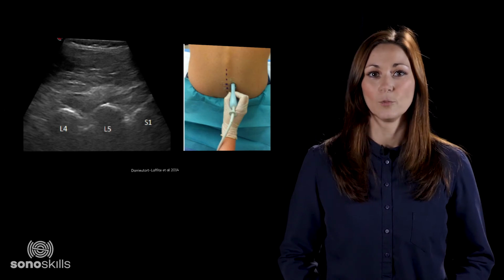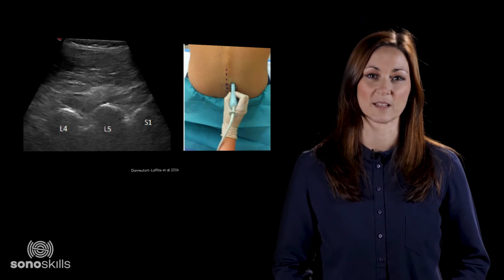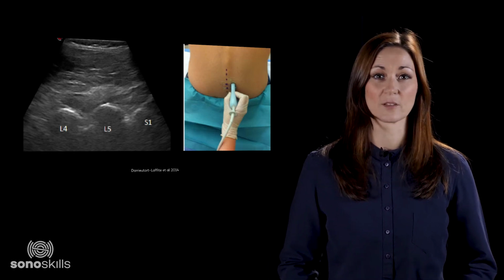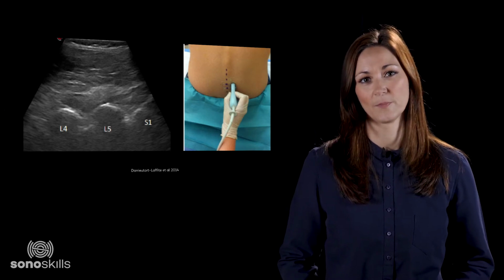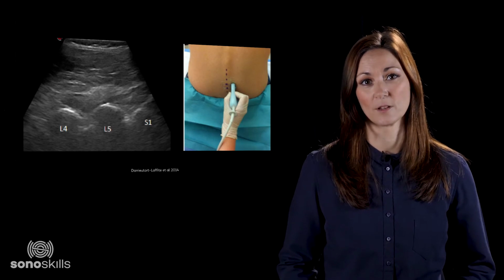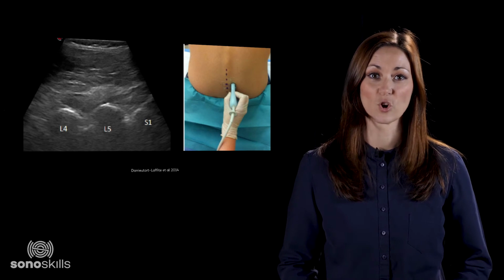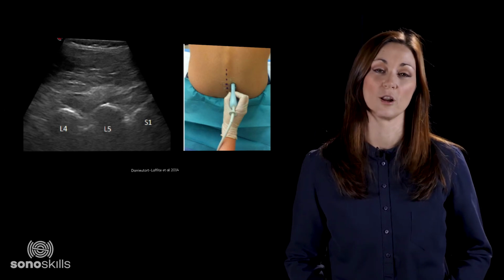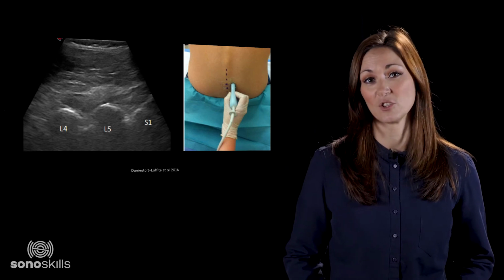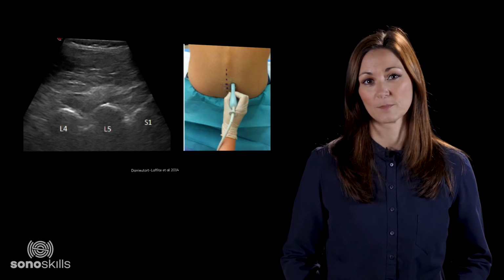The anatomy, which you're scanning, can affect the diagnostic accuracy due to a difference in complexity. In this slide, you can see a musculoskeletal ultrasound scan of the lumbar multifidus muscle. The level L4, L5 and S1 can be easily identified. Above these levels, you can see the multifidus muscle, and at the top, the thin, bright white thoracolumbar fascia. Measuring the multifidus muscle thickness is very easy due to its superficial position and the presence of a few clear landmarks.